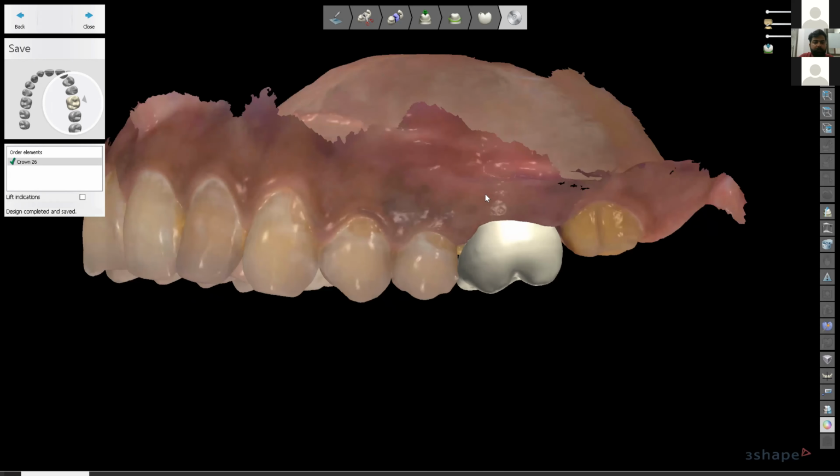If we take it from the intraoral scan, the doctor can do it with the 3Shape scanner. It's a feature in the software that you can take the shade measurement directly with the scanner itself, so there we don't require this. But if there is a model scanner, yes, the dentist has to do the physical shade guide on the patient end.